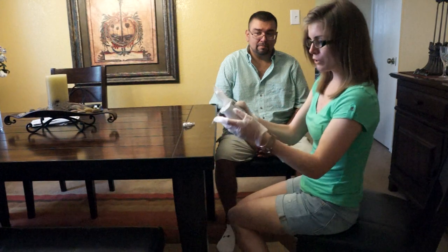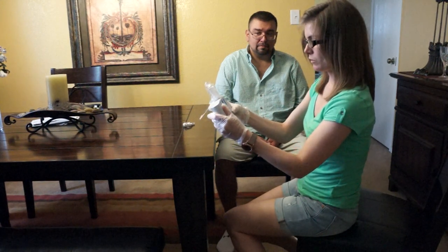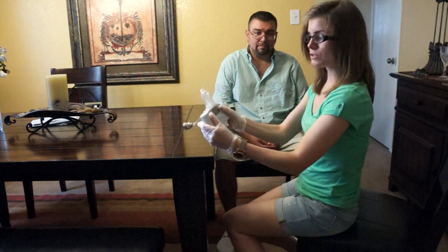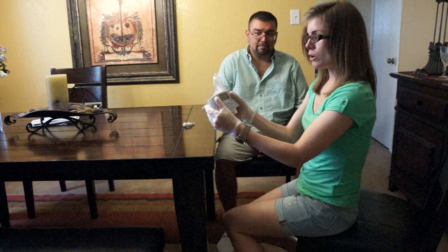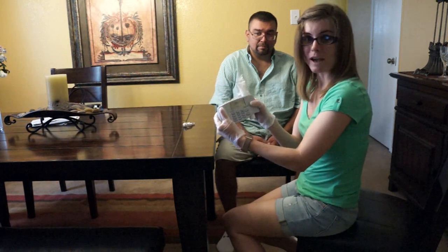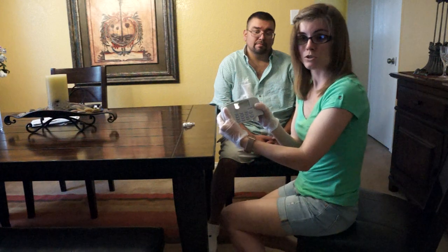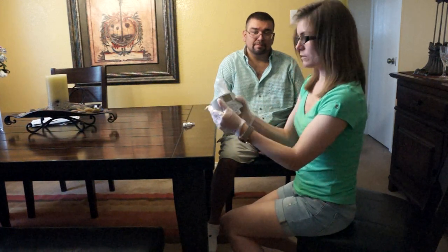So you're going to go in, you're going to hit perform test. So you're going to enter at the top. And then you're going to hit new. Okay, so then you're going to put the subject ID or the name, also age, height, weight. Do they have asthma? Are they a previous smoker? Or do they smoke or do they not smoke? All those questions are going to be asked because that has a big influence on the outcome of the test.